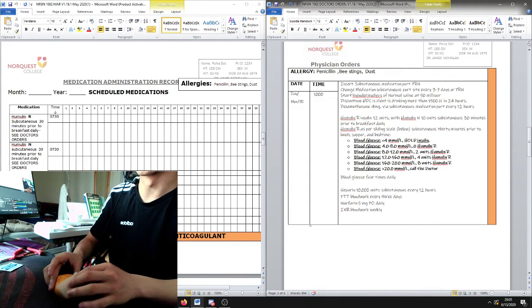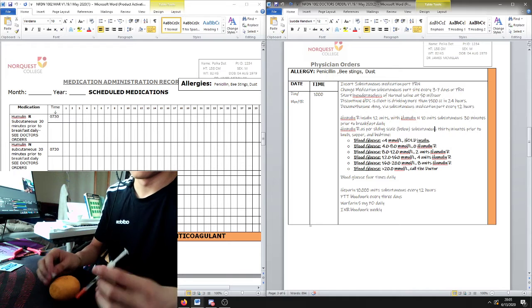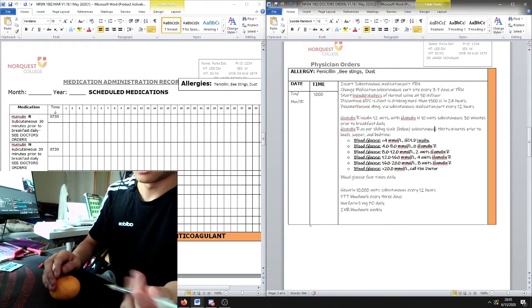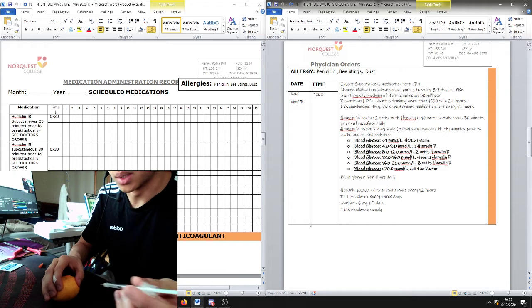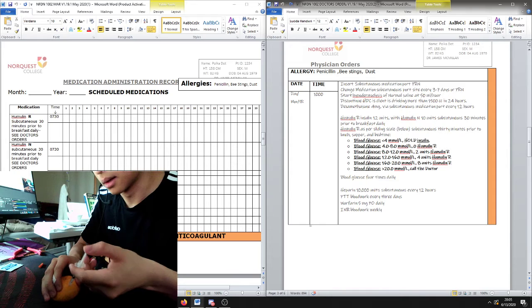And I'm disposing of this. And I have a cotton swab ready. And I'm removing the cap first. I'm going to give a slight pinch, and I'm going to hold it like a dart. And I'm slowly administering the medication.